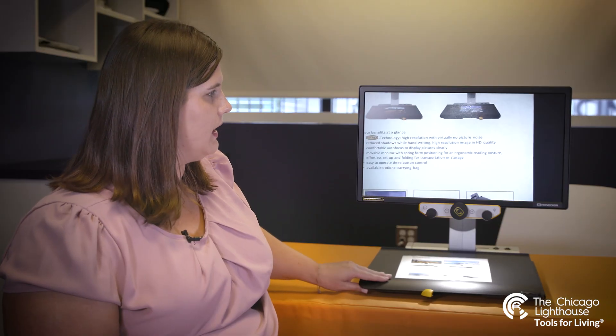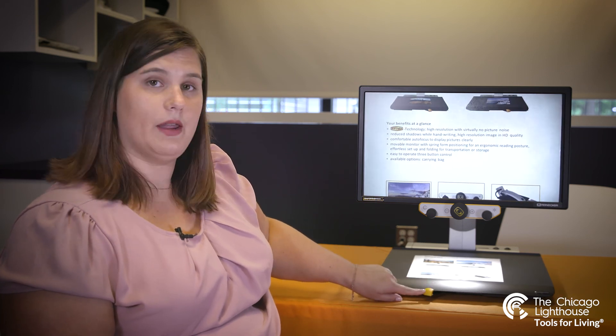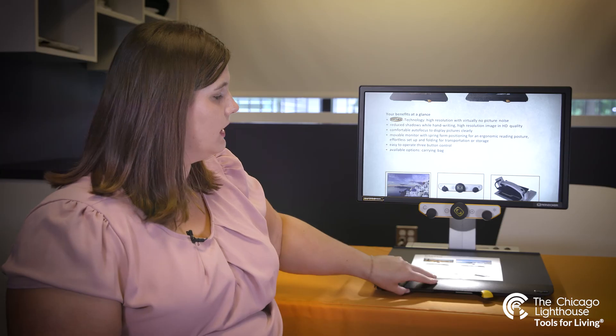Having that XY tray will keep material very still and moving seamlessly. We also have a bar at the base that will lock our XY tray into different positions, should we just want to move it left and right, or lock it fully into place so that it is immovable.